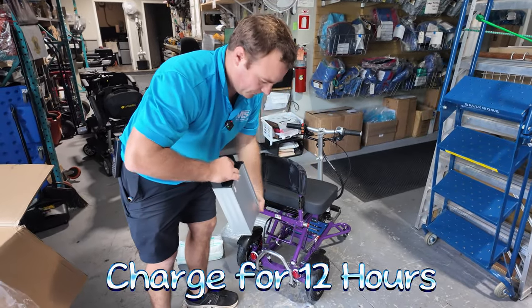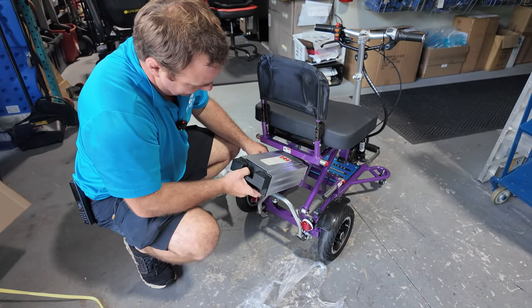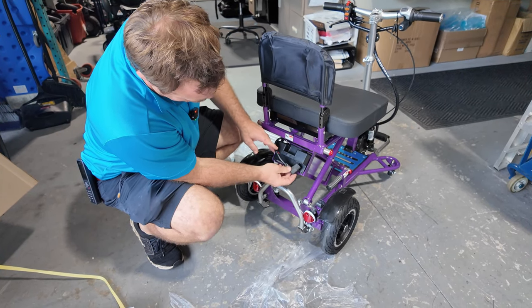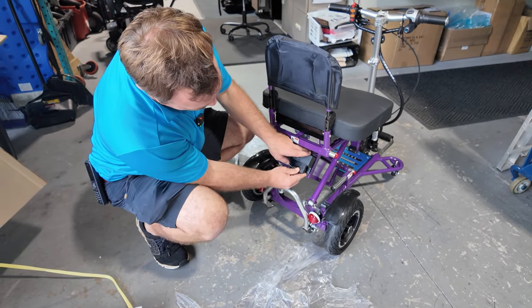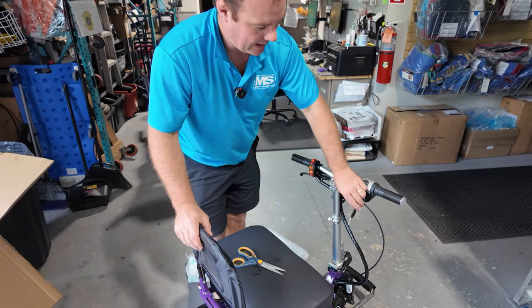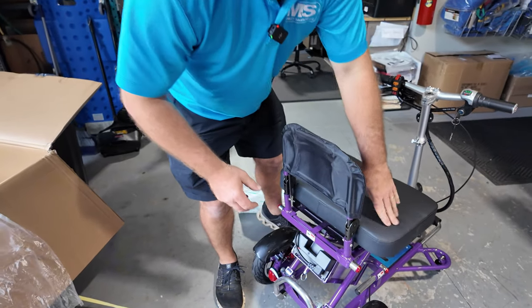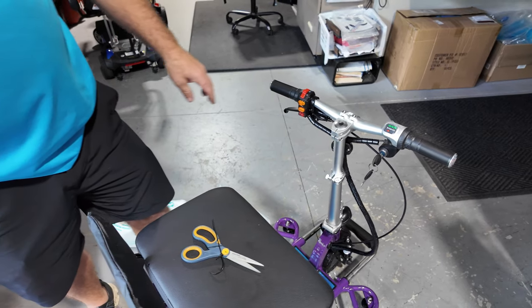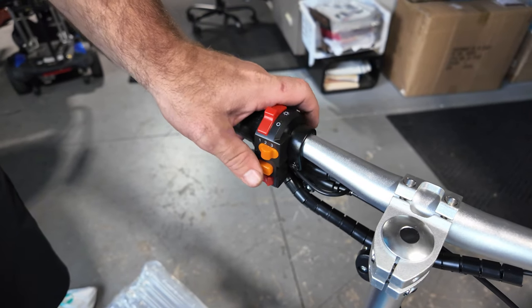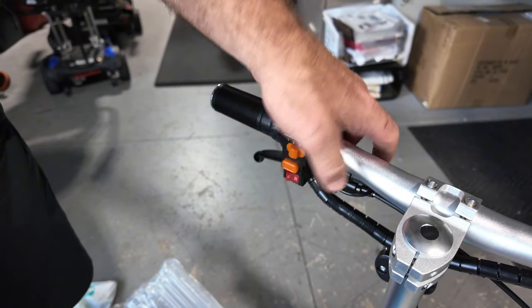The battery is here — charge it up before you use it. It basically slides down here. You can plug it right into here. Just cut that key tag off. When I turned it on, it didn't turn on — so you're going to need to flip that switch back here, and now you have control. There are three speeds: slow, medium, and fast. There's your horn, your lights, your reverse, and that's your forward.